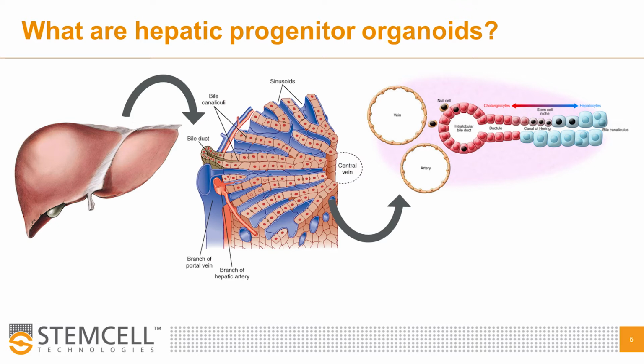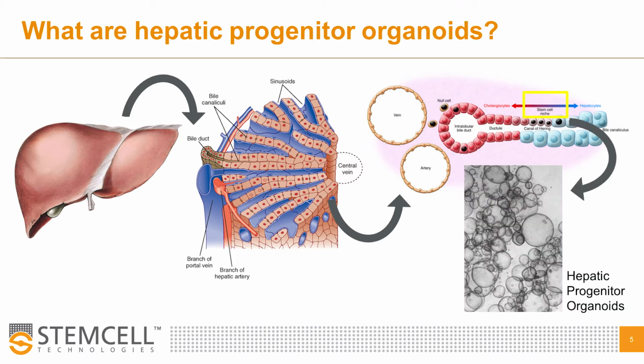This renewal is hypothesized to be driven by Axin2, which plays an important role in the Wnt signaling pathway. In injury, damage-induced LGR5-positive cells have been shown to generate hepatocytes and cholangiocytes in vivo using lineage tracing studies, but LGR5 is not expressed in the healthy liver, which suggests that in the liver, different cells or genes are responsible for regulating the processes of homeostasis, acute and chronic injury. Hepatic progenitor organoids are therefore derived by isolating the liver ducts and culturing the liver stem cells within them.